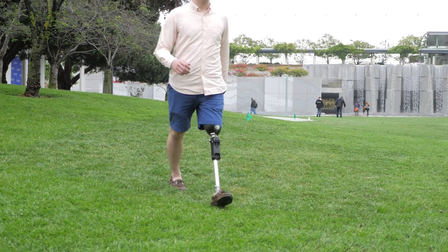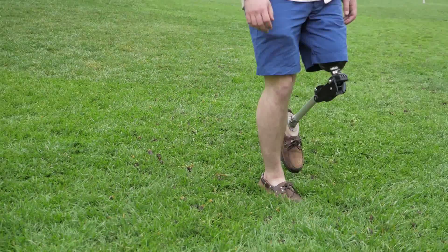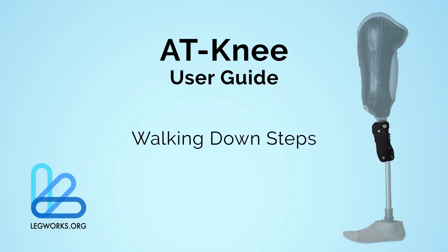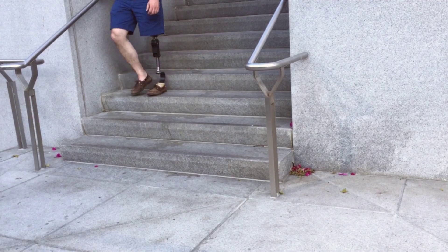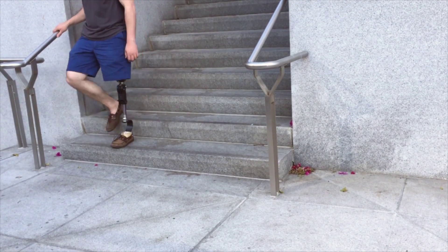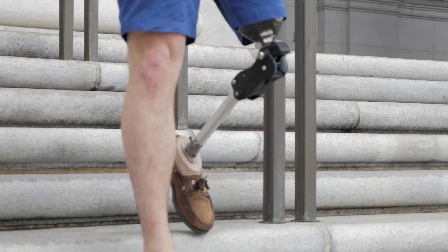Steep slopes may require the amputee to take side steps to descend. For walking down steps, use a handrail whenever possible. Step down with your prosthetic leg and then bring your sound side down to that step. It is important to make sure that the AT-Knee reaches full extension.